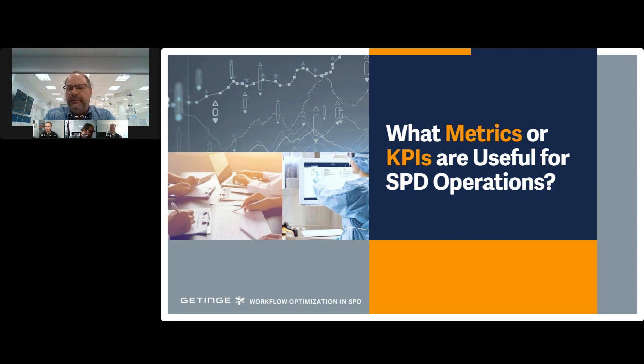If we're turning a set over three times a day, then there's a really good indication that we probably need another one, because it's a recipe for disaster. And you can use that data to show your finance director, here's proof. We're turning the same set over and over and over again, and all you need is one set to have an error or an issue, and that case is either postponed or delayed.